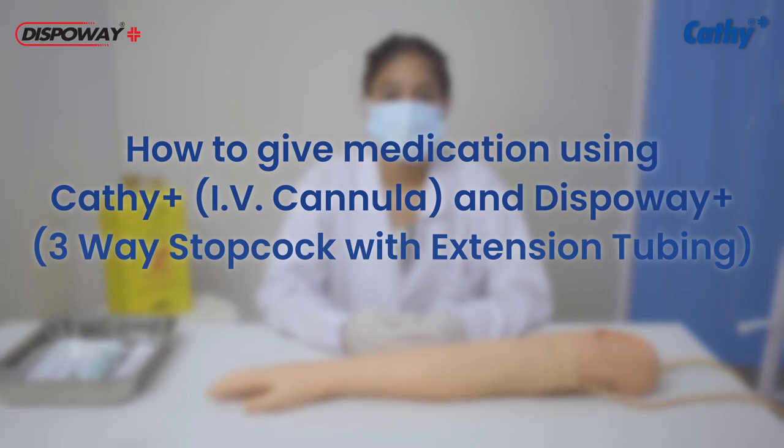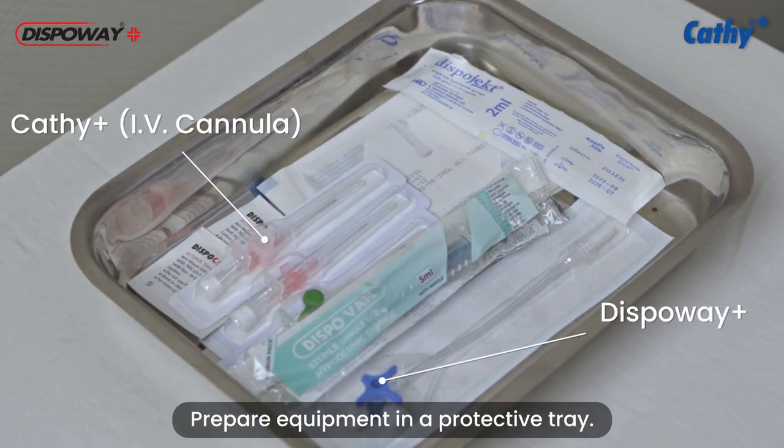Welcome to our comprehensive guide on using Cathy Plus Safety IV Cannula and DispoVay Plus. Before giving medication, prepare equipment in a protective tray using an aseptic non-touch technique.